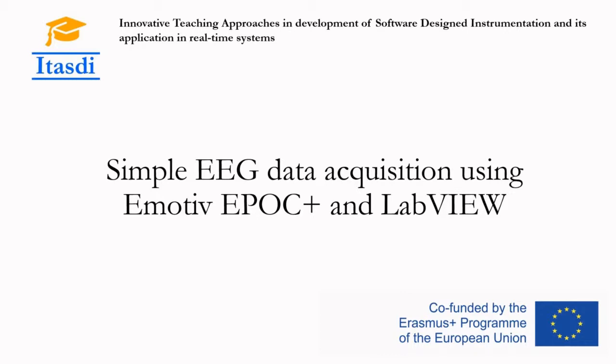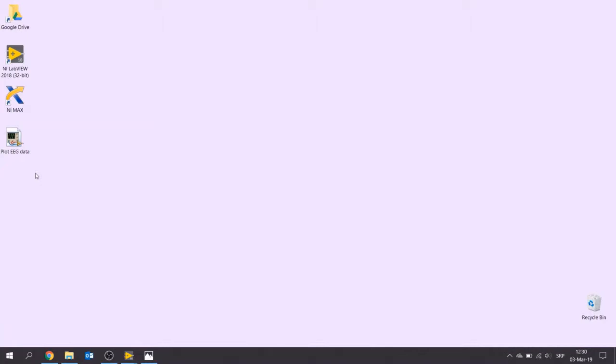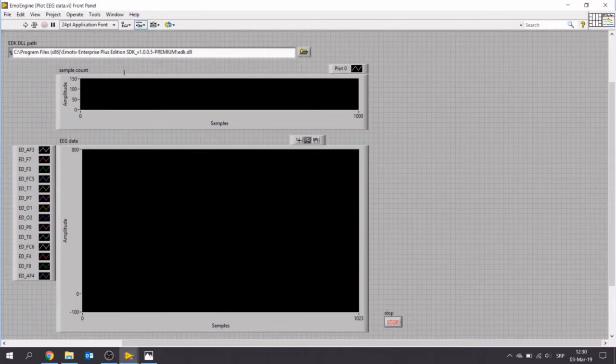Now, a simple EEG data acquisition application using Emotiv EPOC and LabVIEW will be described in detail. For this exercise, we are not going to make a code for acquisition of EEG data, but we are going to look at the example that LabVIEW provides when we install Emotiv toolkit. So I'm going to open this code, and front panel opens. We have two graphic indicators and one path control here, and of course stop button.